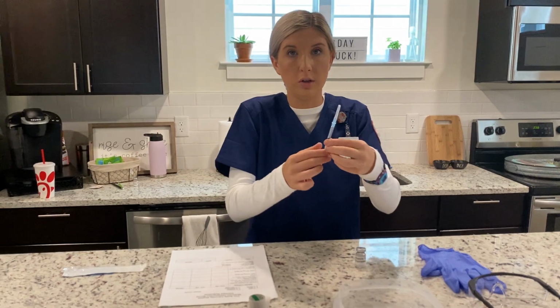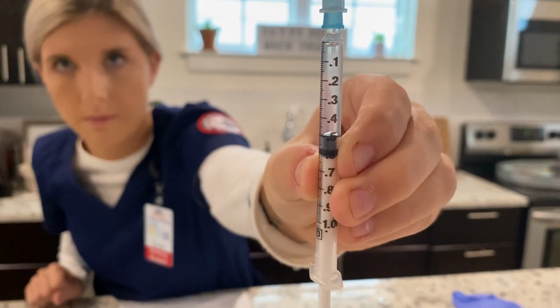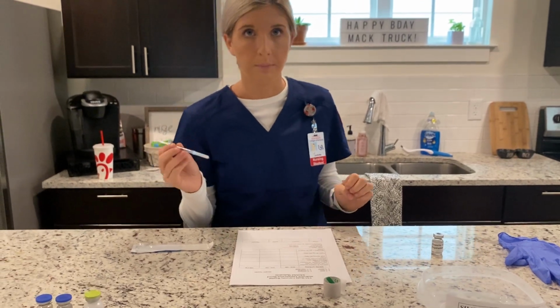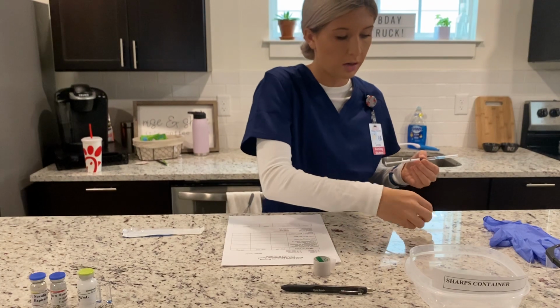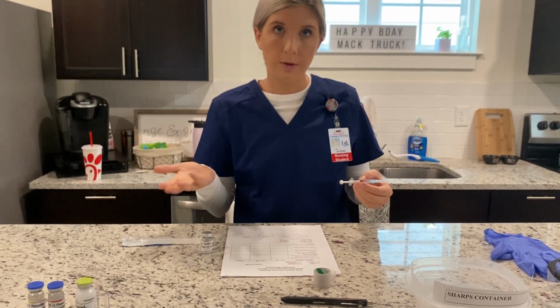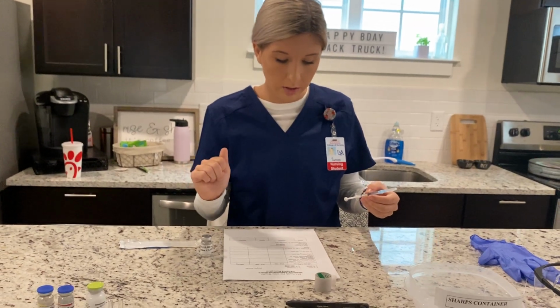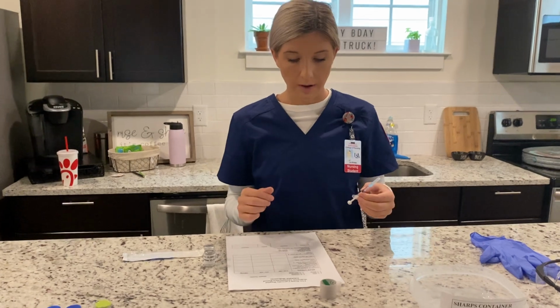And I'm going to show you my syringe. So now I'm going to check on the MAR for the accuracy, and I see that it is heparin and heparin, 5,000 units or 0.5 milliliters and 0.5 milliliters subcutaneously, TB syringe, and then every 12 hours, and it has not been given in the past 12 hours.